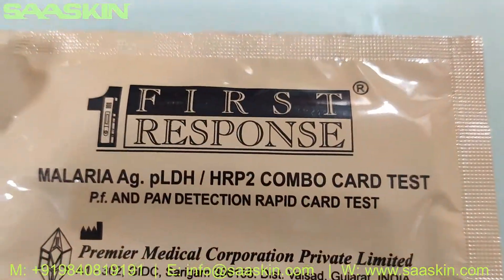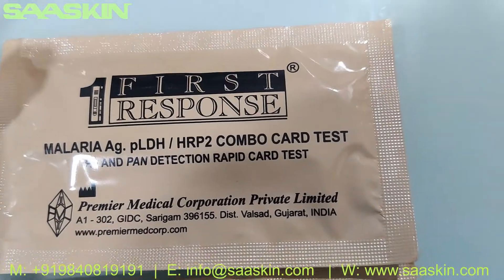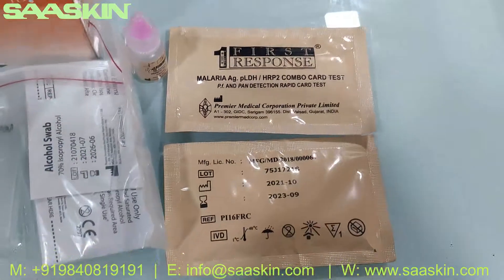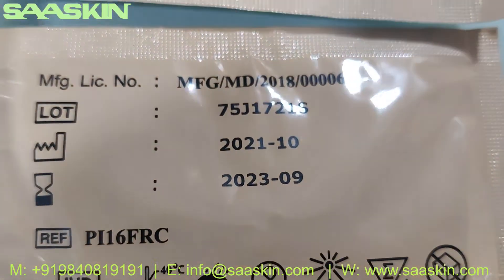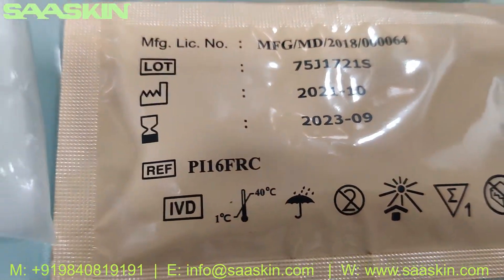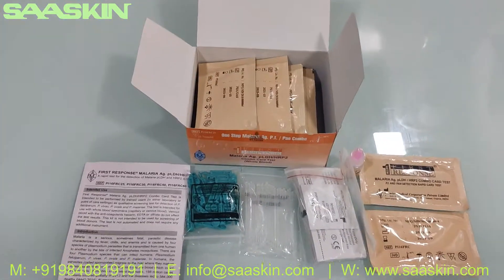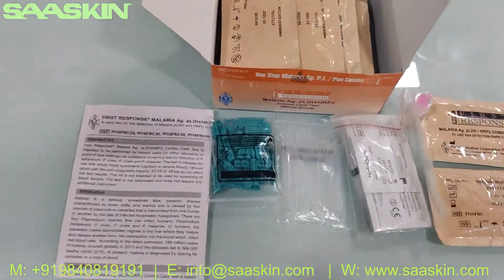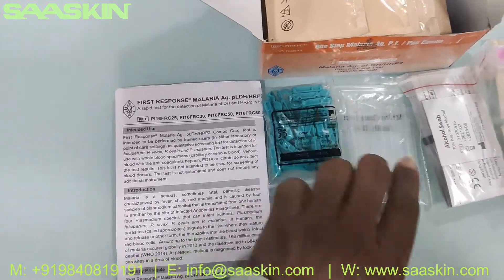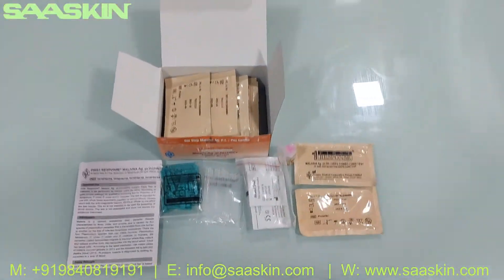If you look closely, this is how the test cassettes look for the Malaria Antigen Pf Pan. You can see it's a Pf Pan detection rapid test from Premier, and the brand is First Response. On the other side of the cassette you can see it has a two-year validity and the reference part number. To summarize, this is a WHO pre-qualified Malaria Pf Pan Combo Test Kit which includes one IFU brochure, 25 lancers, 25 specimen transfer devices, 25 alcohol swabs, 25 test cassettes, and one buffer bottle. This is how the total test kit looks.